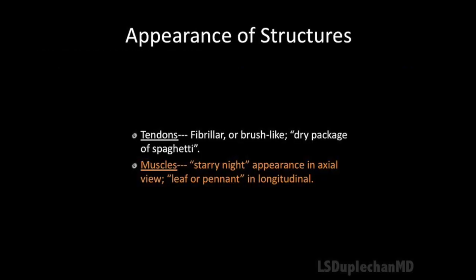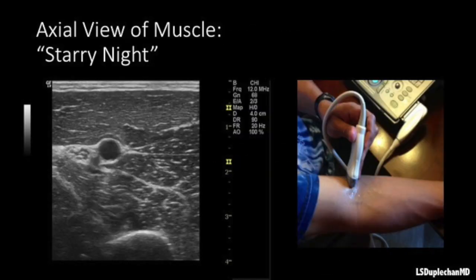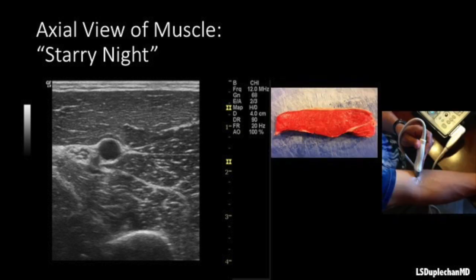Next is the echo appearance of muscles. This is the short axis view of the distal arm just above the elbow. Building the view from the top reveals the biceps muscle and below the brachialis muscle. The neurovascular bundle is in between the muscles. The humerus is noted as a hyperechoic crescent at the bottom of the screen.